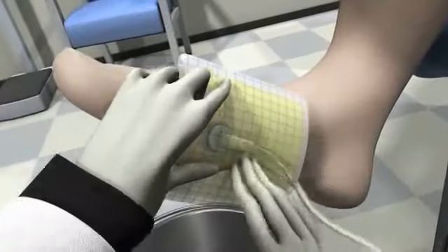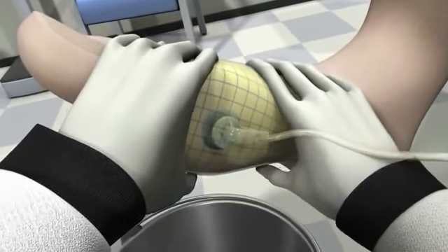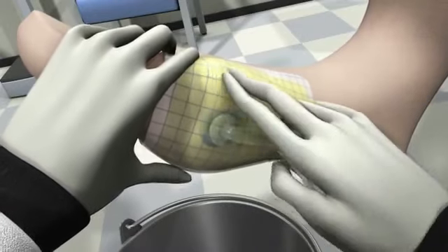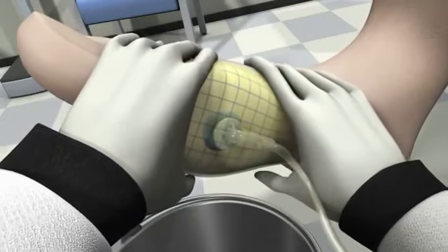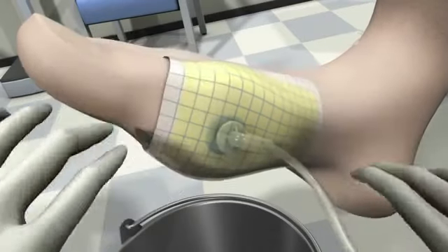Next, remove the side release liners one at a time as you carefully press the rest of the hydrocolloid dressing to the skin. Again, use your hands to smooth out the dressing to ensure an airtight bond to the skin. It's often helpful to hold your warm hands over the dressing to ensure the adhesive properly adheres to the skin.